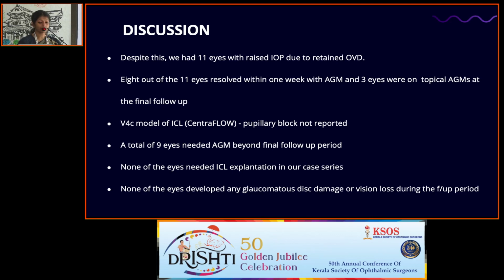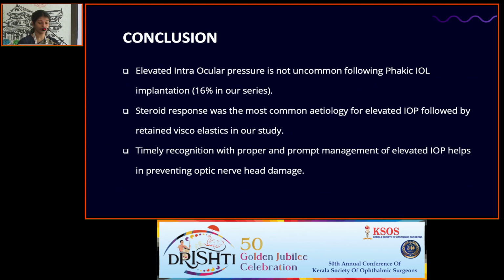8 out of the 11 eyes resolved within 1 week with AGM and 3 eyes were on topical AGMs at the final follow-up. V4C model of ICL was used in our study, so pupillary block was not reported. A total of 9 eyes needed AGM beyond final follow-up period. None of the eyes needed ICL explantation in our case series, and none of the eyes developed any glaucomatous disc damage or vision loss during the follow-up period.